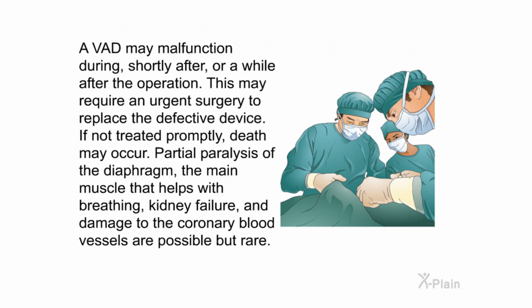A VAD may malfunction during, shortly after, or a while after the operation. This may require an urgent surgery to replace the defective device. If not treated promptly, death may occur. Partial paralysis of the diaphragm, the main muscle that helps with breathing, kidney failure, and damage to the coronary blood vessels are possible but rare.